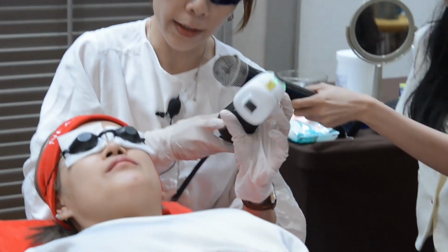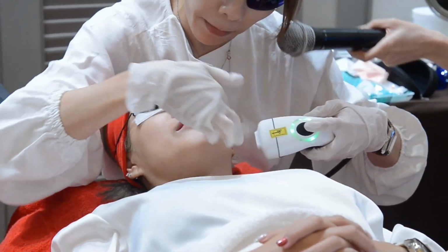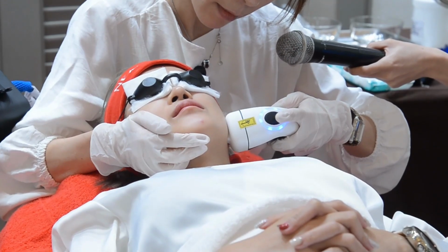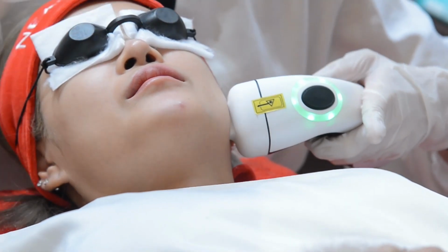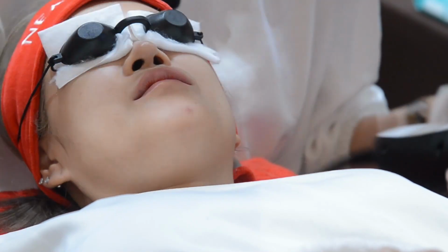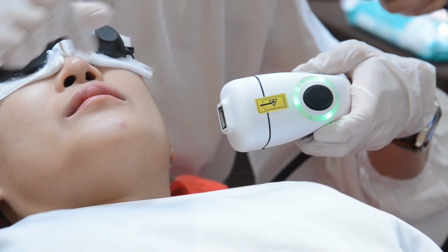So let's say I will start on this area. I will slowly move up. I will just start at a small area first to see how the patient feels. Can you see that when the laser beam is being shot, it's actually blue? How do you feel? Is it okay? She said she's fine. For the next shot, because we have a very small window, you will have to be very close to your previous shot, 45% overlapped.